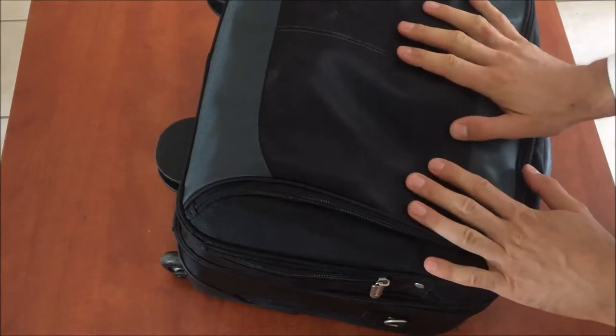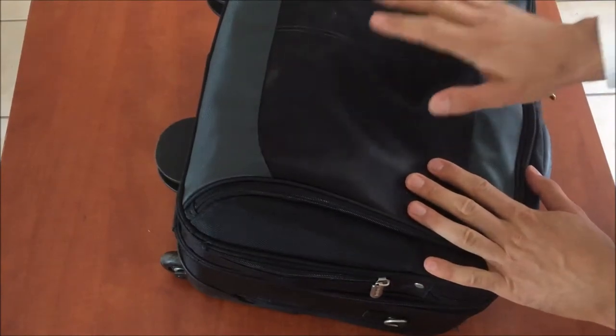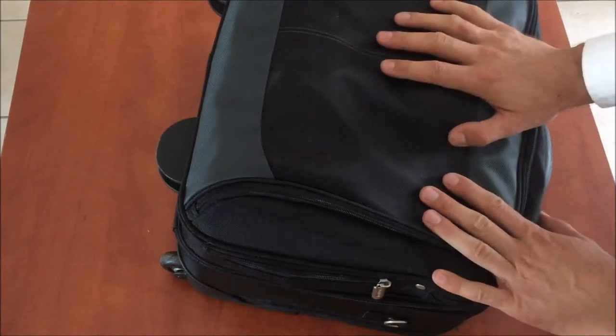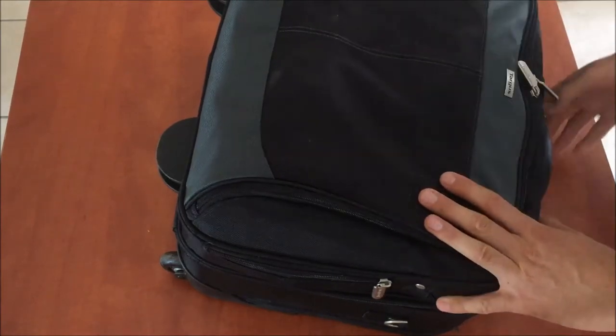Hi, in this video I'm going to share with you what I bring to a house call. I'm a medical doctor who does house calls, and every doctor has their own idea of what to bring on a house call. So I thought I'd share the things that I bring to a patient's home. I have two bags that I bring on a house call. The first is a smaller bag that contains a couple of odds and ends for administration and also everything I need to do a basic examination of the patient.